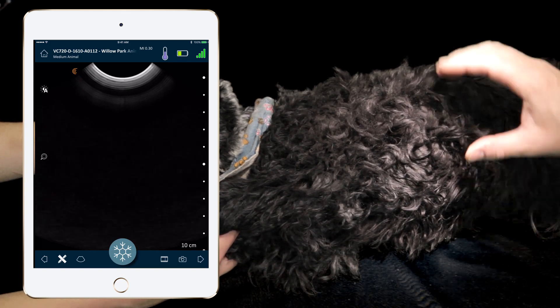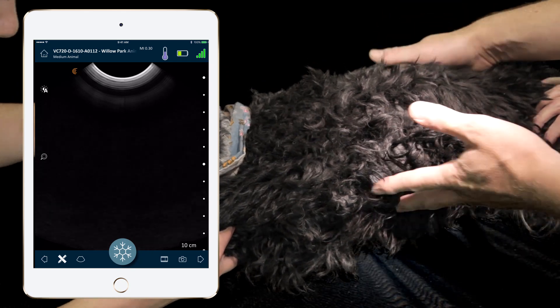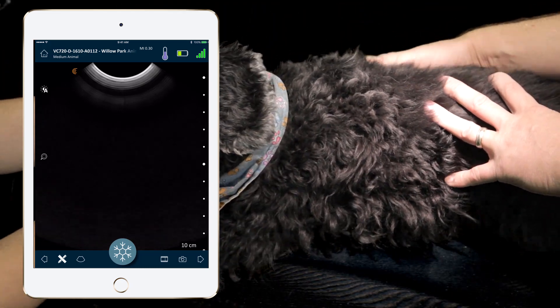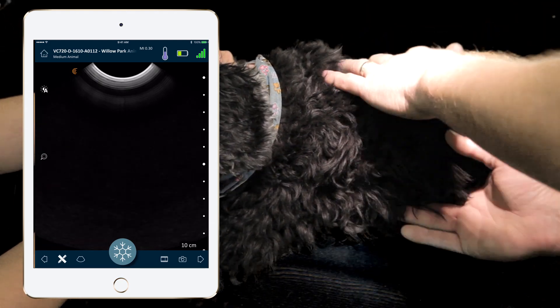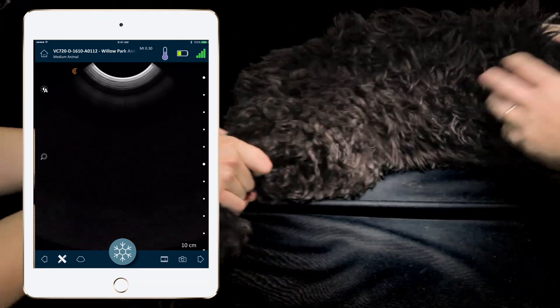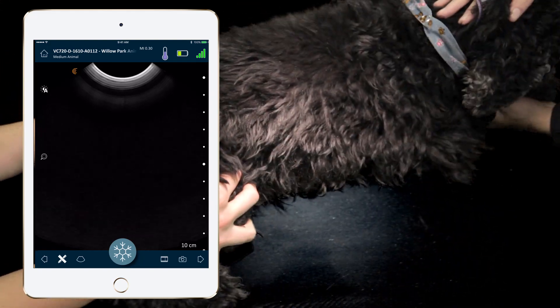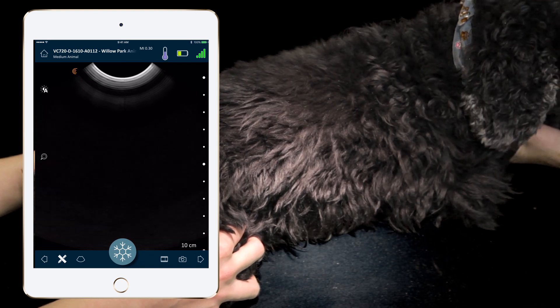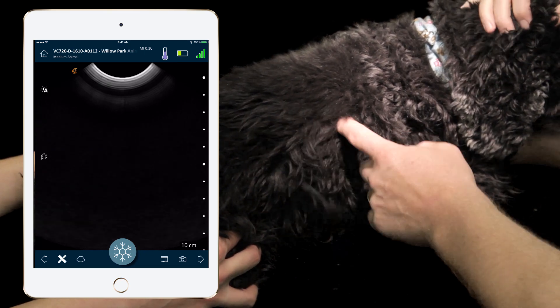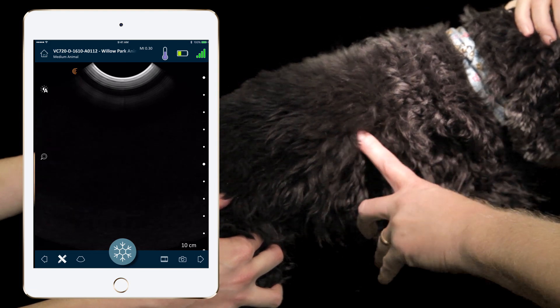Having completed the non-gravity evaluation of the FAST thoracic scan at the pericardial, chest tube, and sub-xiphoid sites, we now want to look at the right side. If the patient is in lateral recumbency, we turn them into sternal recumbency to complete the right-sided gravity-dependent chest tube and pericardial sites. For this video we'll turn the patient to show those sites and their landmarks. We can do the entire scan in right sternal recumbency if the patient is unstable.